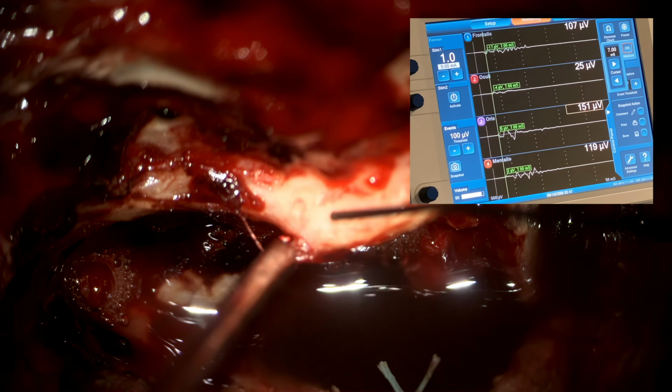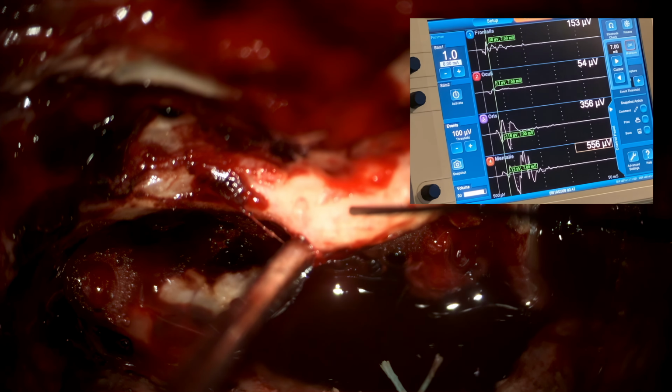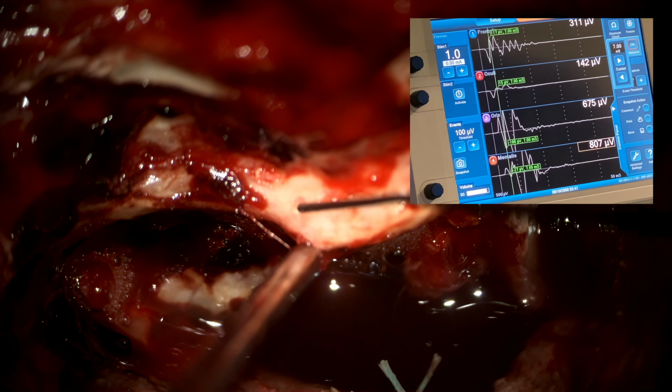Over here. Okay, we got something here. Now put it down to 0.7. See, here at 1.0 it does nothing. 0.7. Okay, there it went because it's a little raw bone. Here it went. Look. Here, tap.